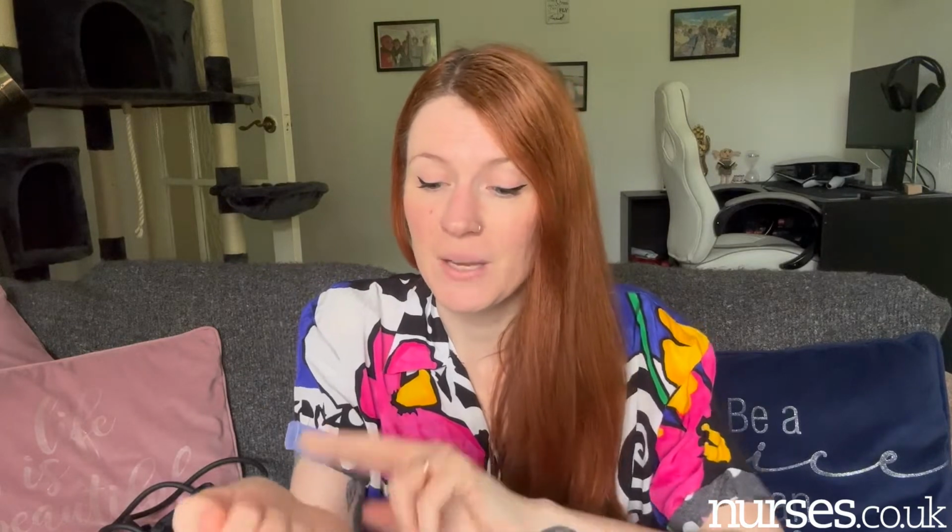It measures the oxygen within the body. It also comes up with a heart rate. However, I don't find these 100% reliable for heart rate. And not only that, we should be doing a physical check of the heart rate over 60 seconds, because what this doesn't account for is anyone with an abnormal rhythm.